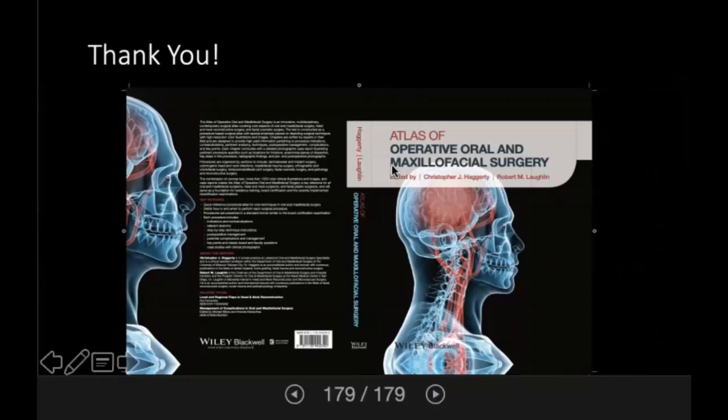Okay, and there is another question here that says, on the tissue level posterior implants on the last case, what size locator cuff height did you use, 1 millimeter? Well, because I'm an oral surgeon, that is up to the restorative dentist or the prosthodontist. However, typically you'd like to have about 1.5 to 2 millimeters of that locator extending above the tissue. That's about how much you need to sufficiently engage your locator housing.